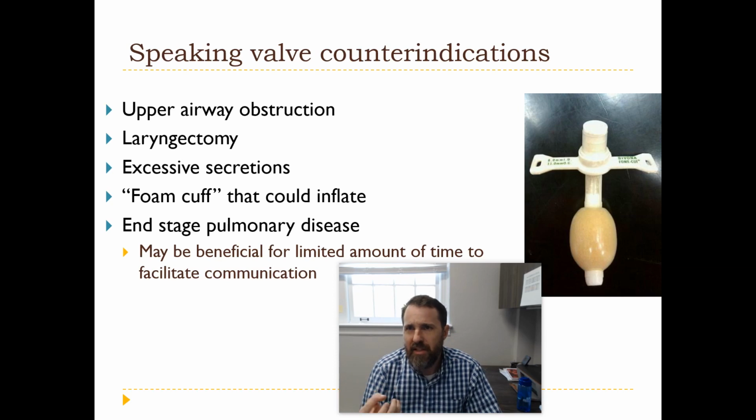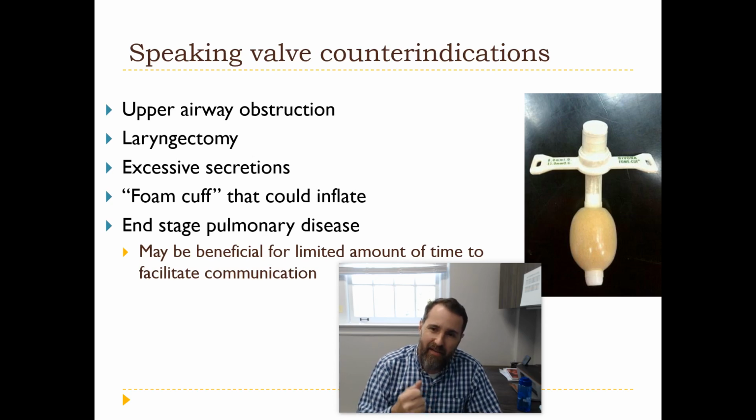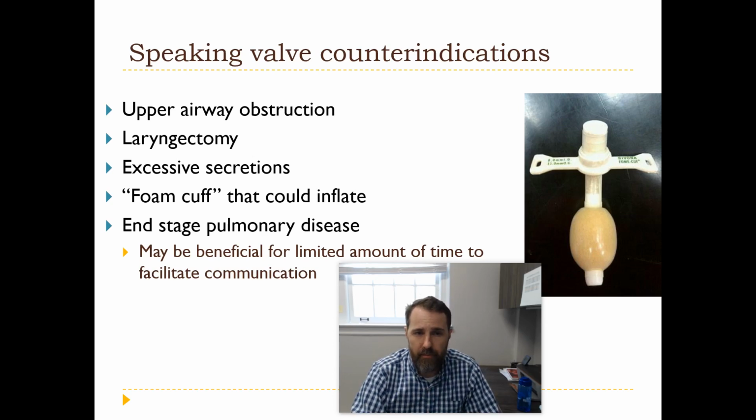And even when you deflate it, it occupies more space between the trachea and the tracheostomy tube. And that can be a negative thing for expiration, especially if the tracheostomy tube is not fenestrated.